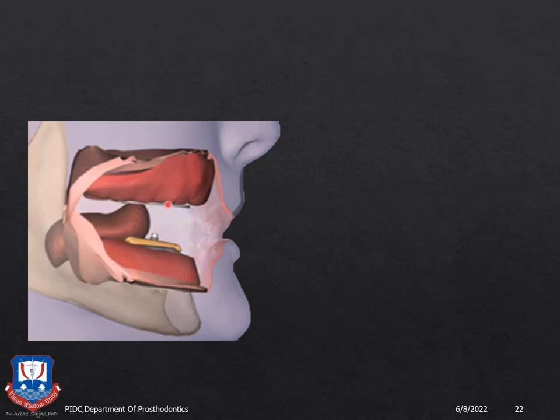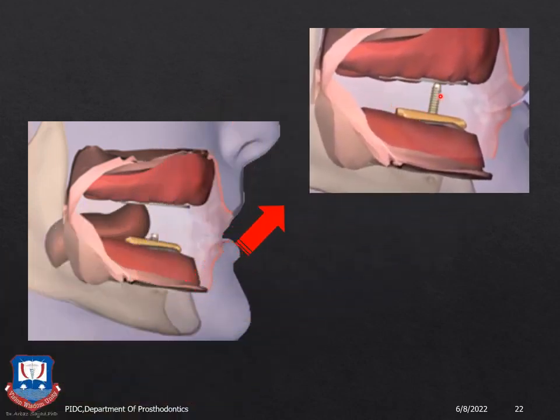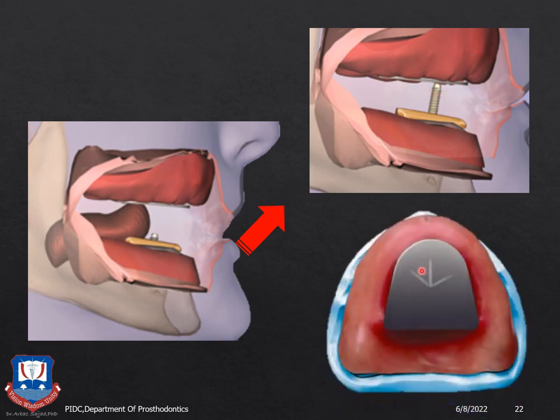This central plate or the sheet of metal is first coated either with soot, that is by passing it over a flame or a candle, or it is coated with a thin layer of plaster or a thin layer of inlay wax. So this is how the central bearing plunger or styli makes the marking on the upper plate of the intraoral tracer, and this is the arrow pointing towards the throat of the patient.